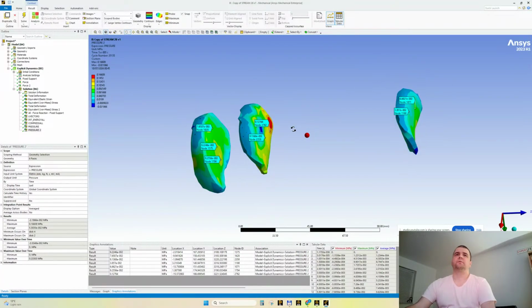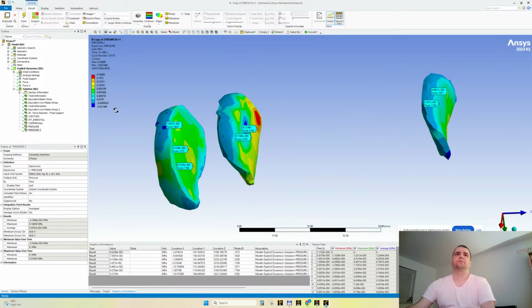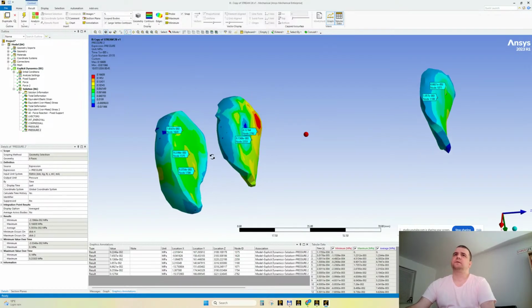So for those of you who didn't know how to acquire the pressure on some faces, this is how you do it in Explicit Dynamics.